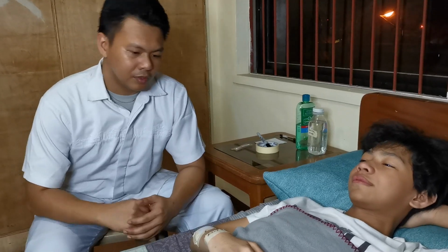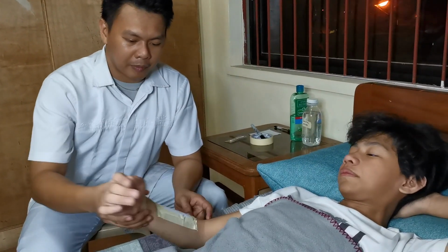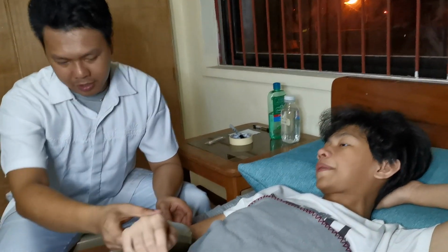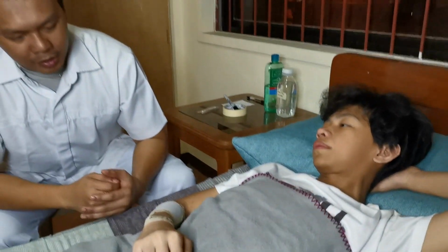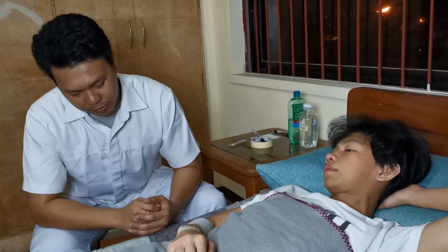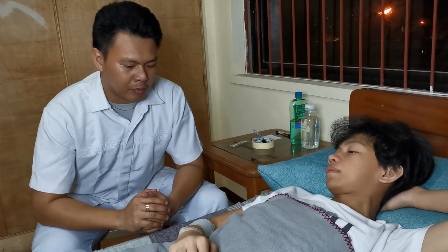Sige, thank you. Number 5, observe for presence of retained irrigants. This is done to make sure that all irrigants are dried off and removed to prevent skin irritation. So check nato, sir, ha, kung naa bay nabilin nga irrigant solution o naa bay magbasa-basa. So far, okay naman, nauga naman, natanggal na nato tanang solution. So para dili ma-irritate imong panit.